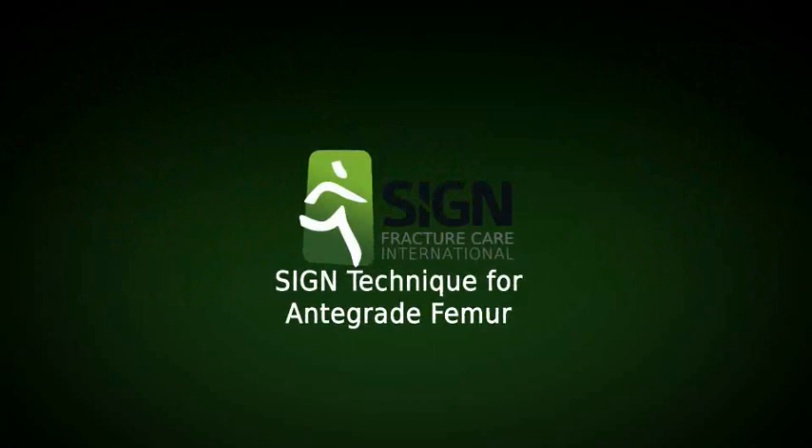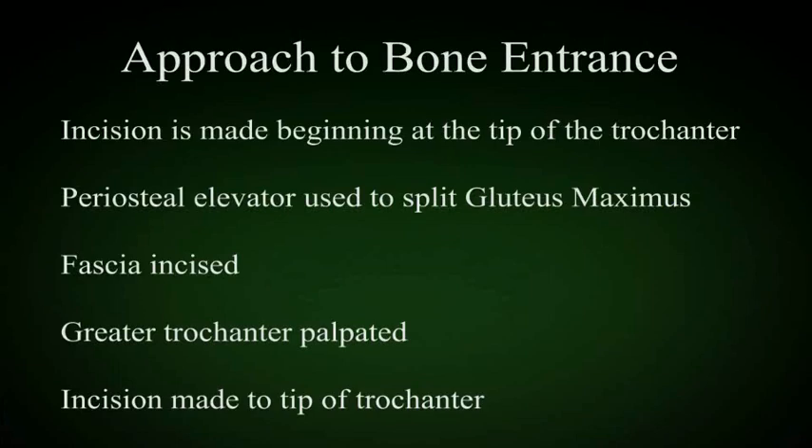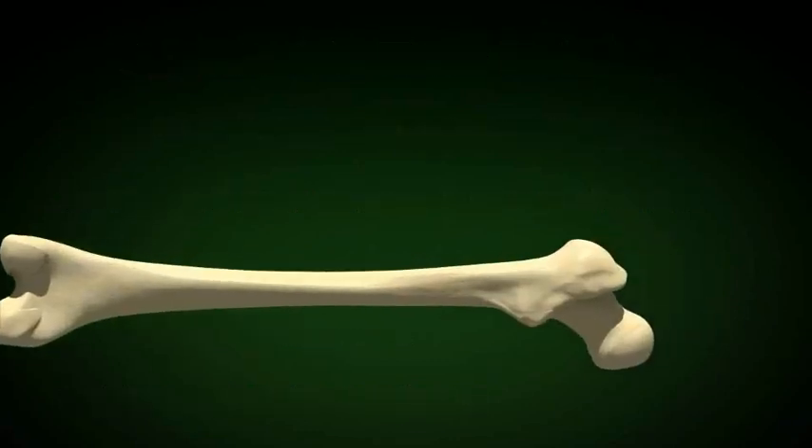The Sign Technique for Antegrade Femur is shown in this animated video. The approach to the bone entrance is listed on the screen and covered in the technique video. We use the trochanteric approach.